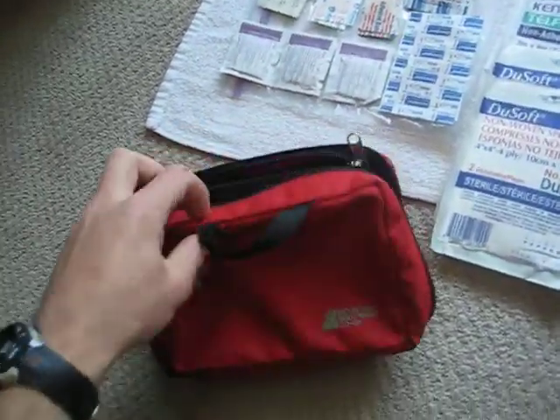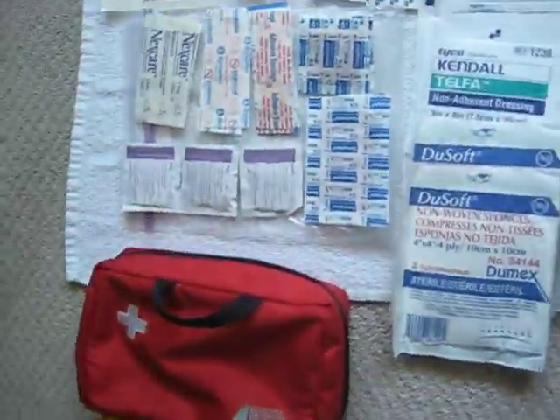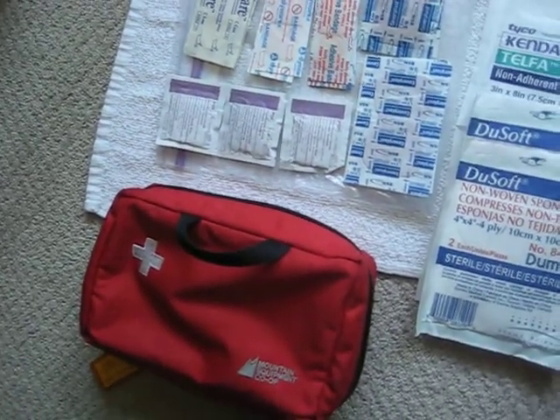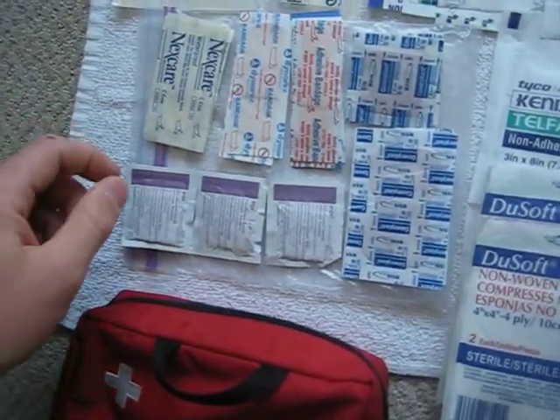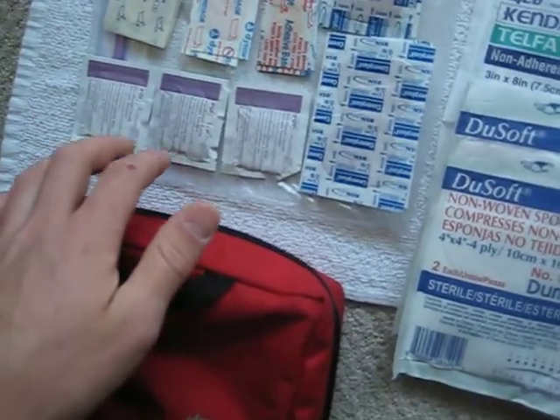Here's the bag it all carries in. It's quite compact, waterproof, organized well, so that when you go in and get something, you don't have the vomiting type thing where all the contents of the kit go everywhere. So I'll start with minor wound, Ziploc bag here for all the minor wound stuff.